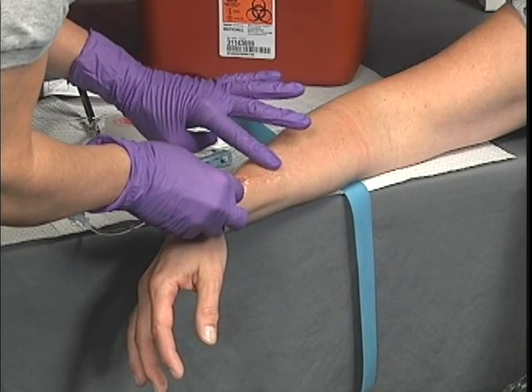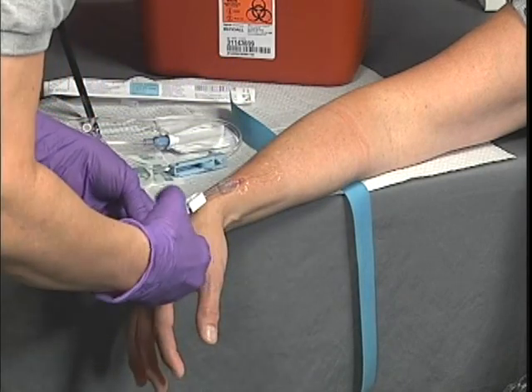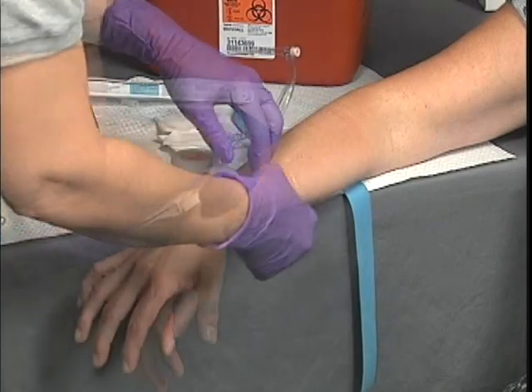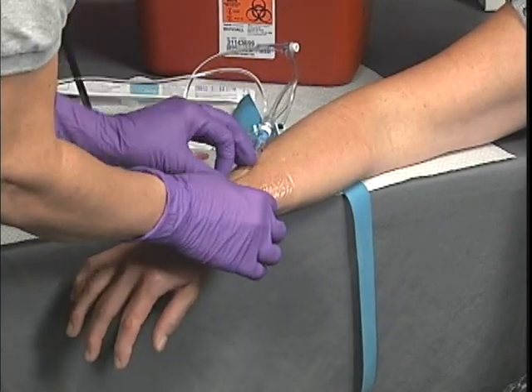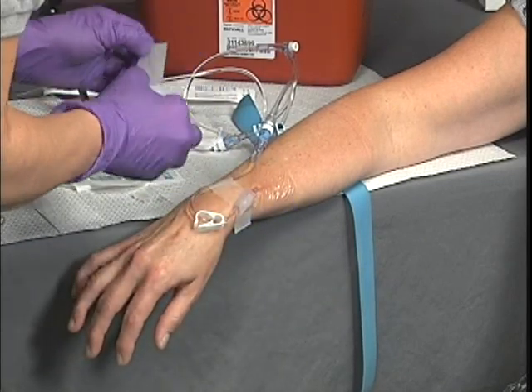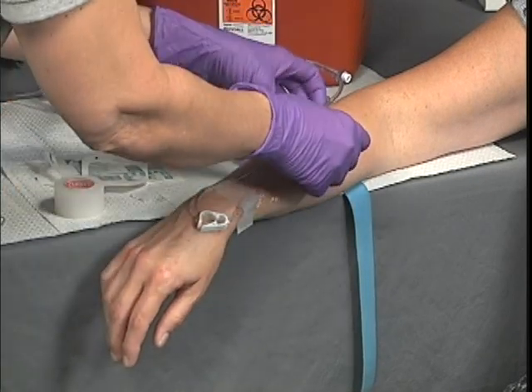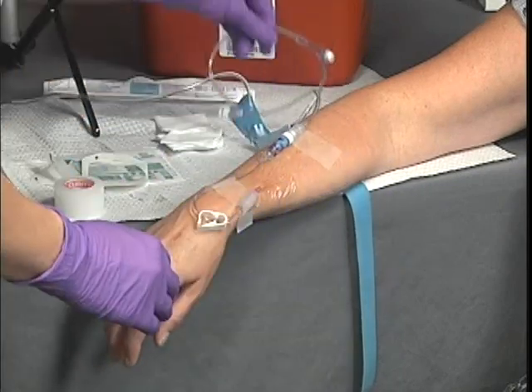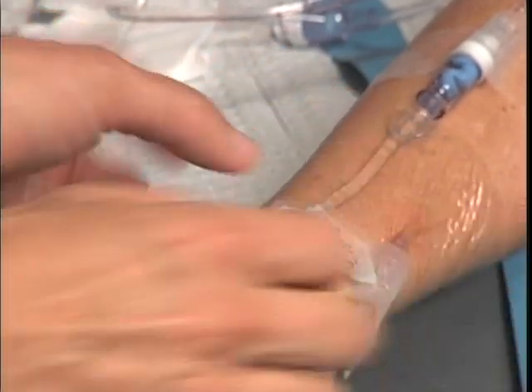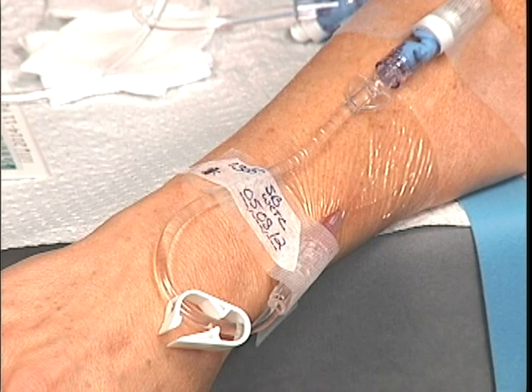Cover the insertion site with a sterile dressing or commercially available device. Many taping methods and commercial securing devices are available — follow your local protocols. Adjust the flow rate by closing the flow clamp or other flow metering devices to the appropriate setting. Continue to monitor the patient for signs of fluid overload or other complications resulting from the IV. Maintain the appropriate flow rate and watch for infiltration. Some protocols may require you to initial and date the IV cannulation.